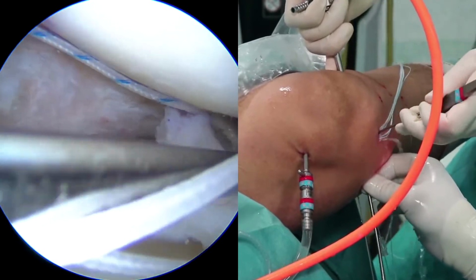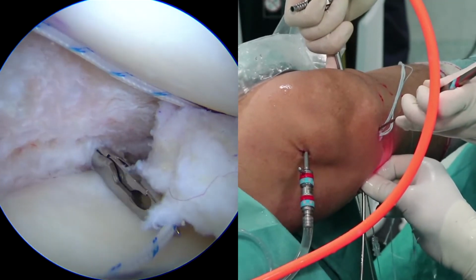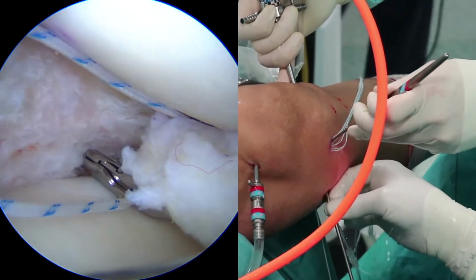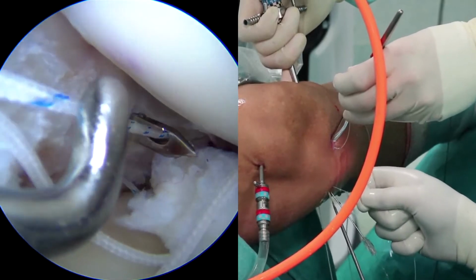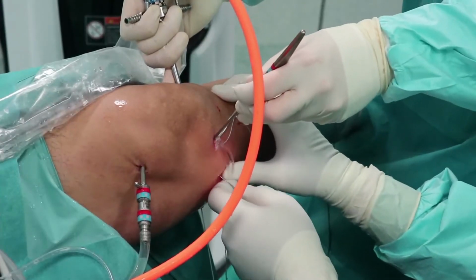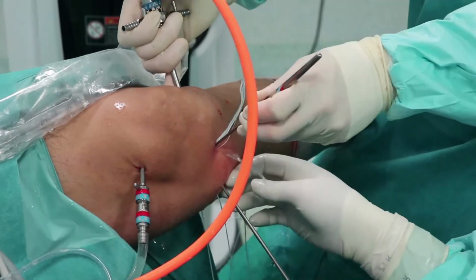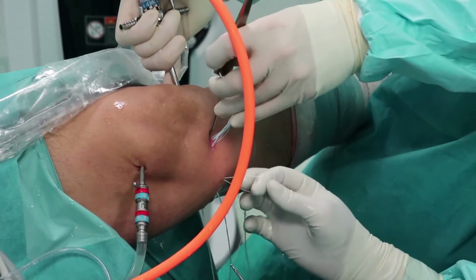But before suturing, the correct placement and balance of the graft must be checked, maintaining tension from the meniscal root sutures at all times. An assistant will be in charge of extracting the sutures, with special attention to do it in the right order and not to unload any of them. Our task during this phase is to create the space with the probe in between the graft and the meniscal rim, presenting the sutures to our assistant.